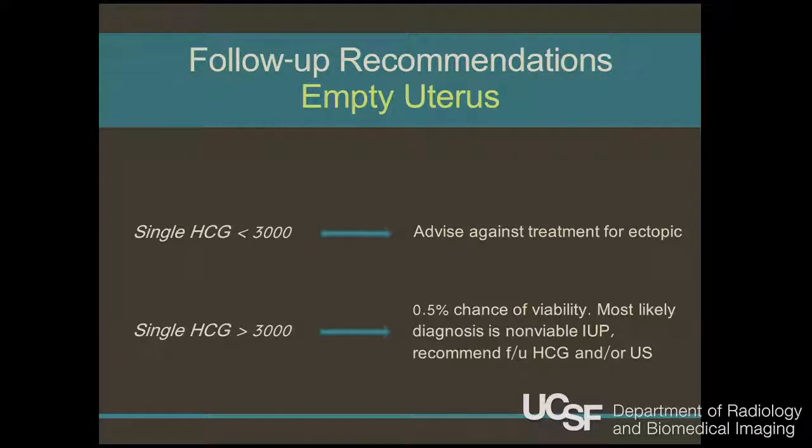So your job, in my mind, as a radiologist, is to diagnose whether there's an intrauterine pregnancy or not, or whether you see signs of ectopic. If the beta is 5,000 or 1,000, the obstetrician or gynecologist has to take that data, synthesize it with your report, and then decide what to do about it. I don't ever look at the beta because it doesn't change my interpretation. As a matter of fact, it could almost screw you up into thinking, it's too low, that's probably nothing, or it's high, we should tell him to do this or that. My advice is not to not look at it, but don't let it interfere with your interpretation.